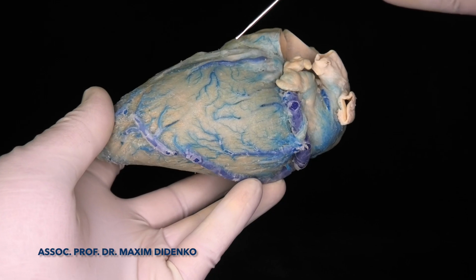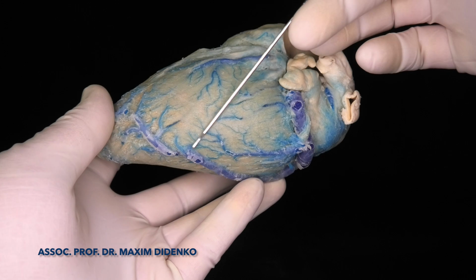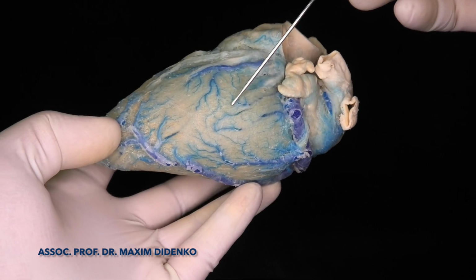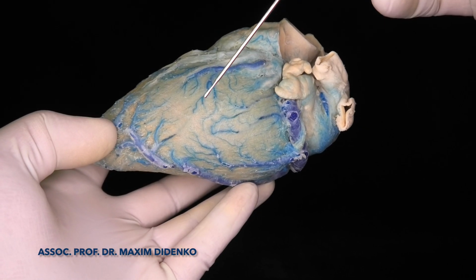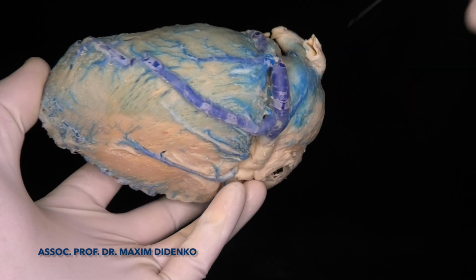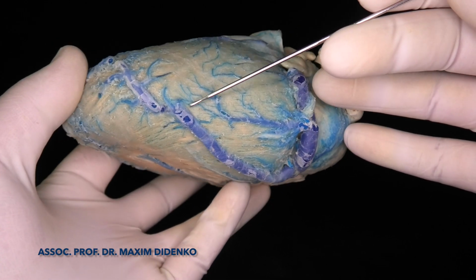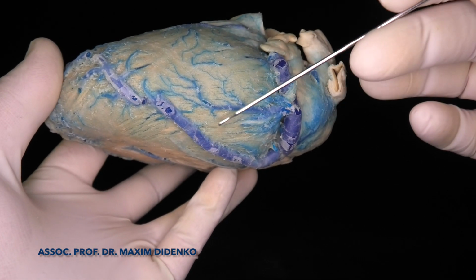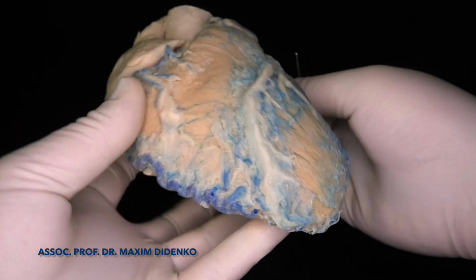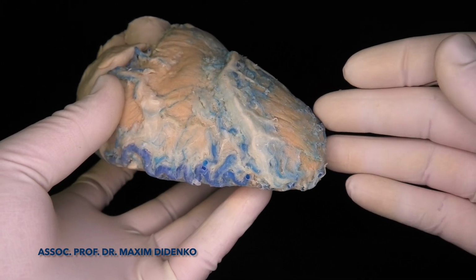For CRT, we know that the mid part of the lateral wall of the left ventricle can be optimal in most cases for cardiac resynchronization therapy. It's interesting that in this particular case, this vein is located more posteriorly, but this can also be nicely used, especially if the right ventricle lead will be implanted in the right ventricle septum.